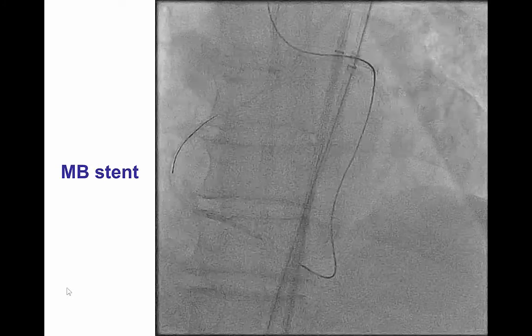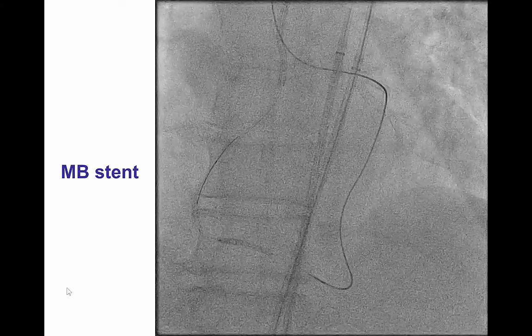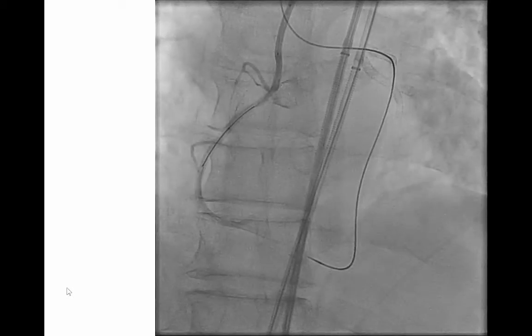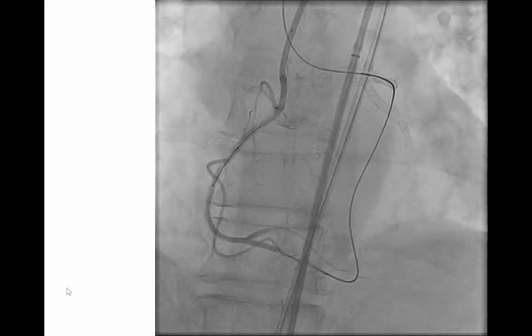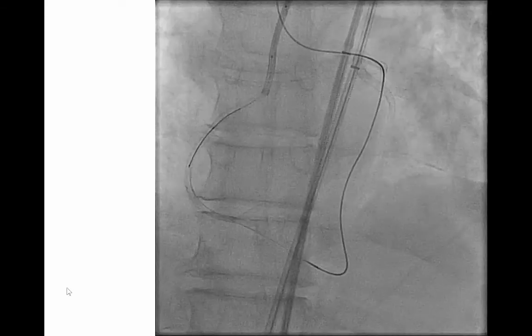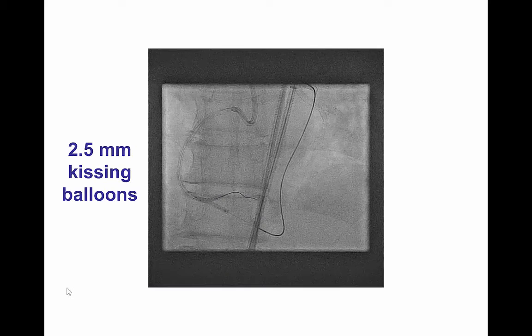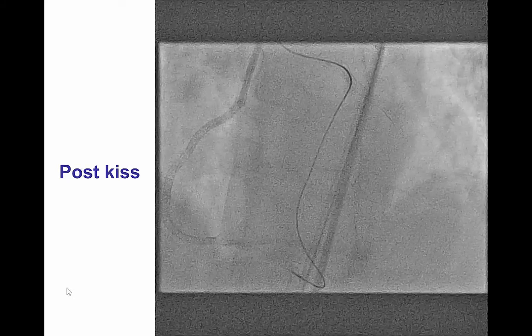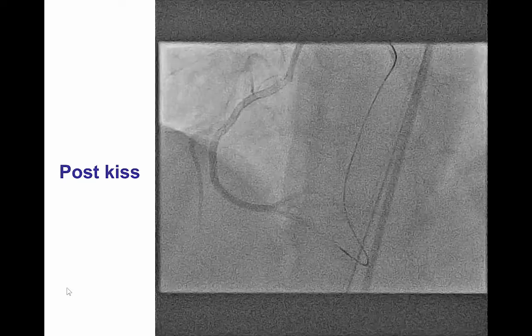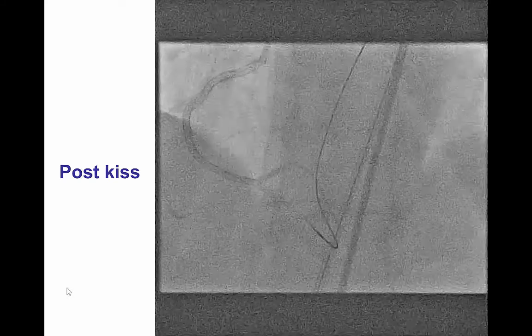This was followed by stenting of the posterolateral and the posterior descending artery with two stents. The PLV stent was deployed first, and the PDA branch stent was subsequently deployed, restoring flow both in the PDA and the posterolateral vessel. We then rewired into the posterolateral with the PILOT 200 guide wire and performed kissing balloons, restoring good flow in both branches.